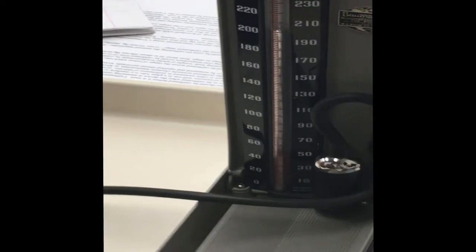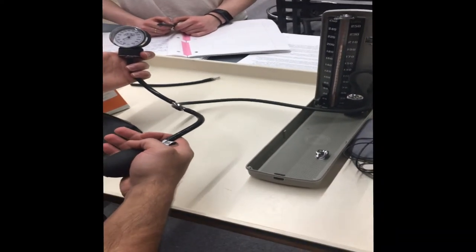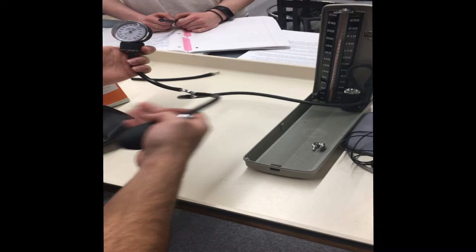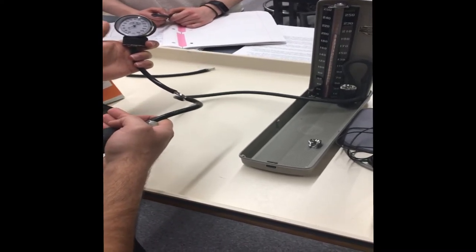By lowering the pressure and writing down what you see on each one, you avoid the problem of hysteresis in the system, and you can construct a calibration curve to correct for the values that you get with the aneroid manometer.